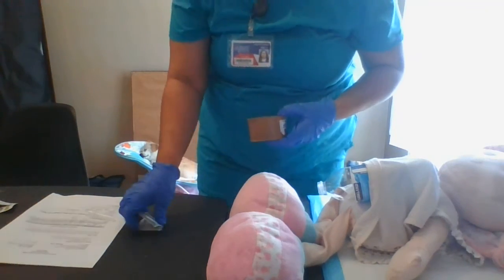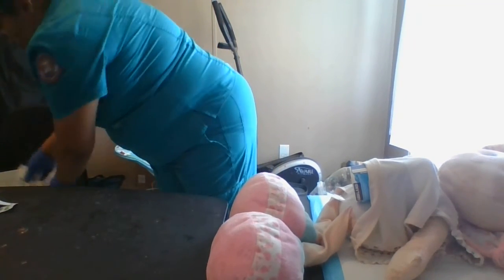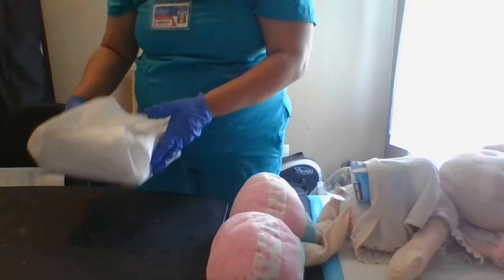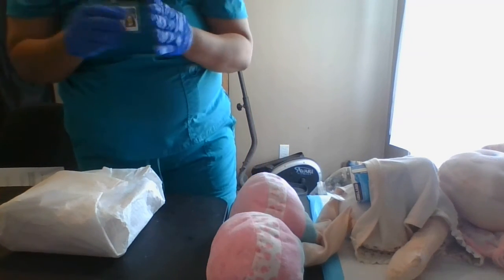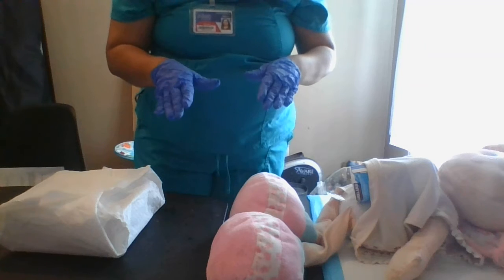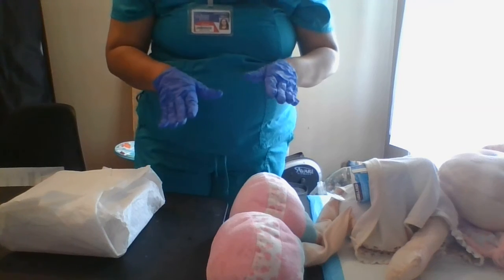Okay, thank you. Now we're going to do your Foley catheter. Have you had a Foley catheter inserted before? You have? Okay. So there shouldn't be much pain. There might be some discomfort and you might feel a little bit of pressure. That's okay. But you shouldn't feel any extreme pain. If you do, please let me know so that I can stop.